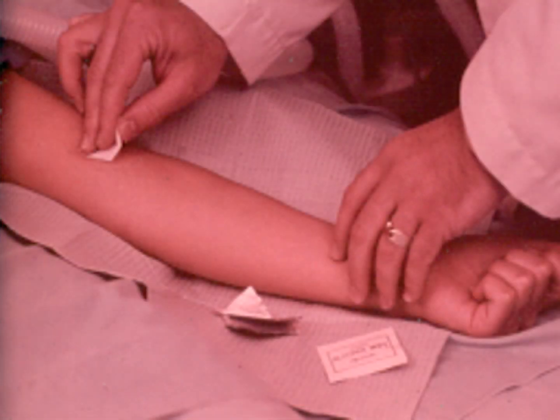Radial site. That's something that we'll be looking at too. The radial site, once you feel for the site, you're going to palpate it, and then you're going to wipe it clean, and then you're going to, of course, wear gloves, which this person is not doing. Heavens to Betsy. You're going to wear your gloves while you're doing this whole thing. You're going to palpate the site, you're going to clean the site, then you're going to perform the puncture itself, and so we'll get into that more later.